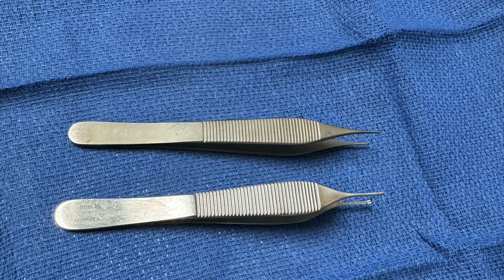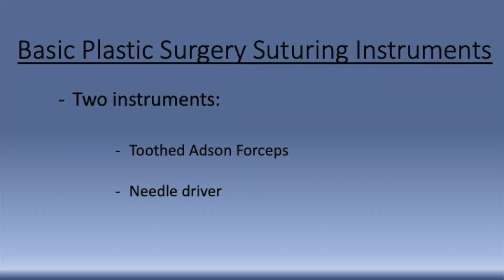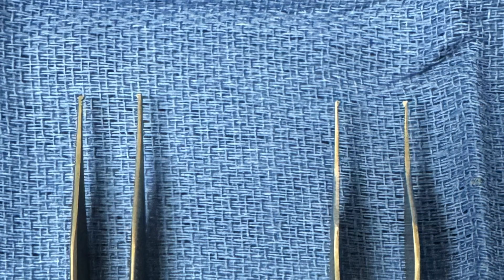There are many different types of forceps that are used in plastic surgery. For suturing, the toothed Adson forcep is the most important. The toothed Adson forceps are designed with small teeth which allows the skin to be held atraumatically. Non-toothed Adson forceps such as a DeBakey forcep or an Adson Brown forcep should not be used on the skin because the blunt end will crush the tissue and cause damage.